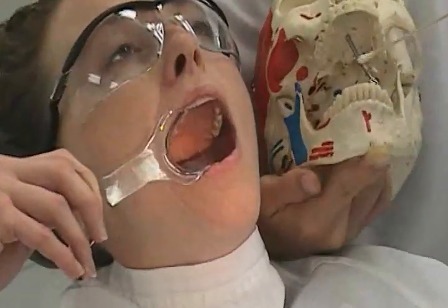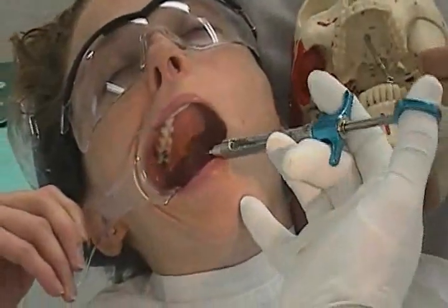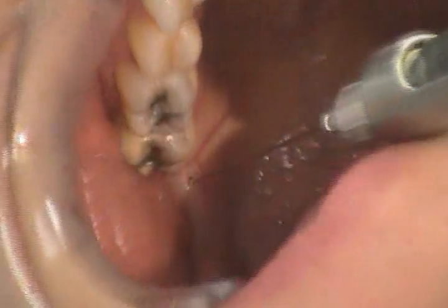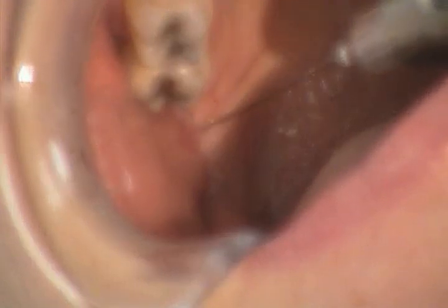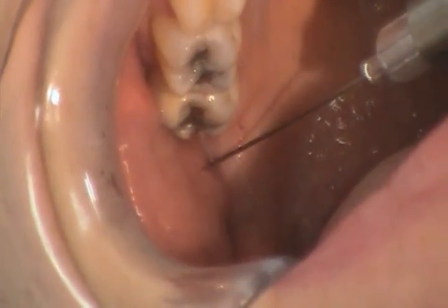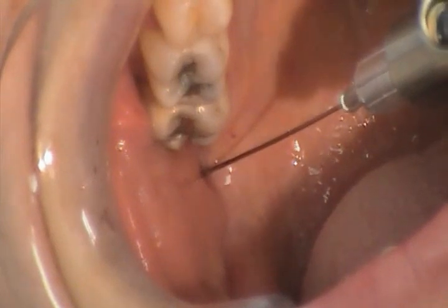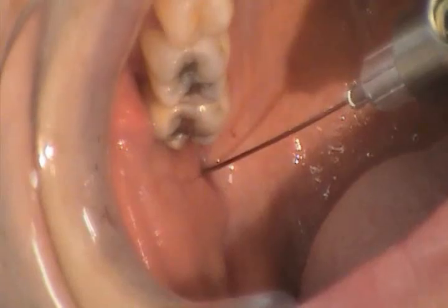Intraoral landmarks are the height of injection established by placement of the needle tip just below the mesial lingual, mesial palatal cusp of the maxillary second molar. Penetration of soft tissues just distal to the maxillary second molar at the height established in the preceding step. The orientation of the bevel is not critical.